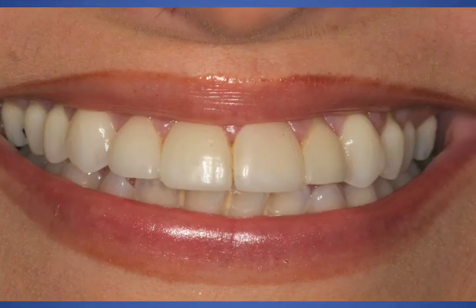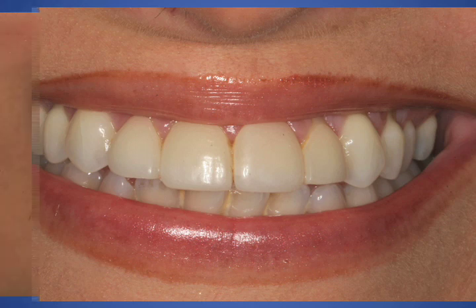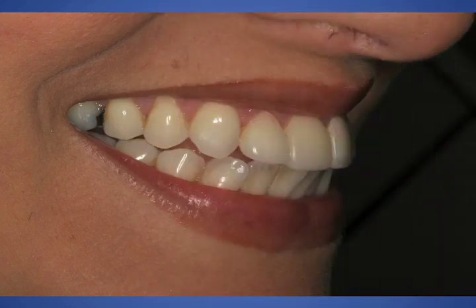So let's look at our patient right now. This is the preoperative photograph of her high smile line. The lateral incisors and two maxillary central incisors are fairly mobile. She has some real concerns with aesthetics and function. She'll tell you that she would not be able to bite into a breadstick or feel comfortable going to a restaurant. She felt that she was going to lose those teeth shortly, which affected her emotionally.